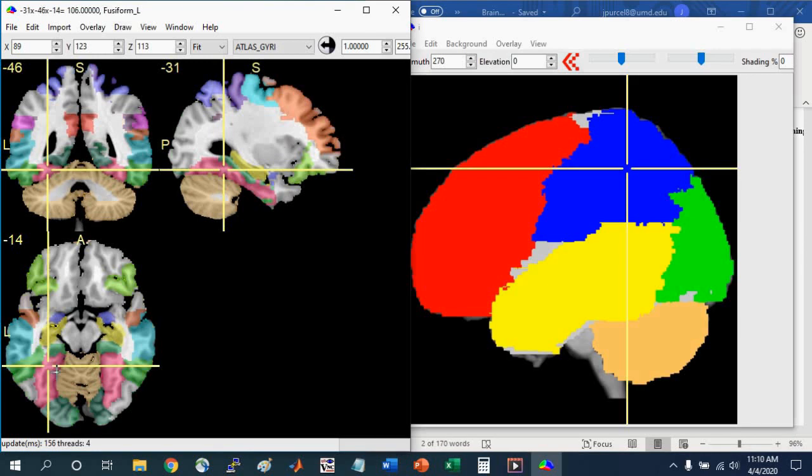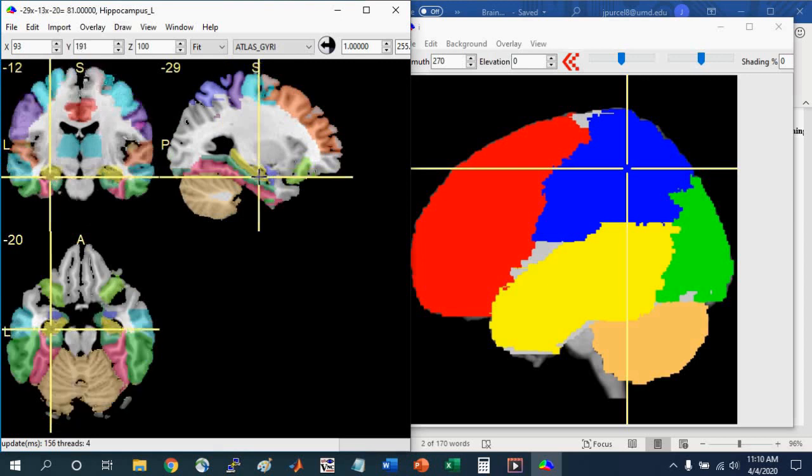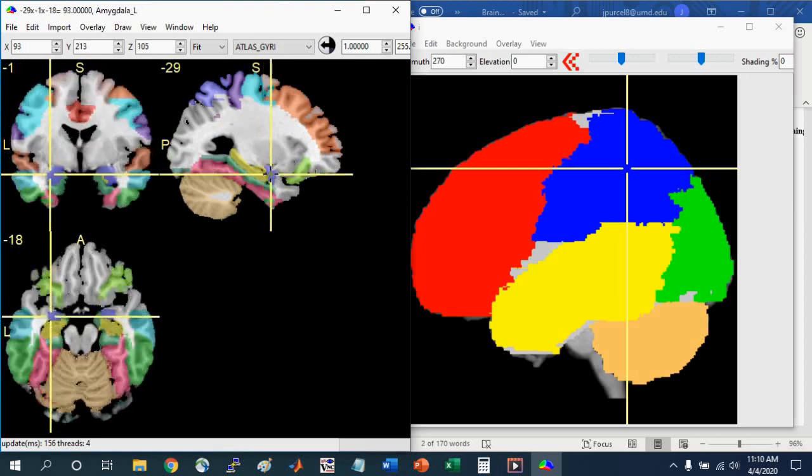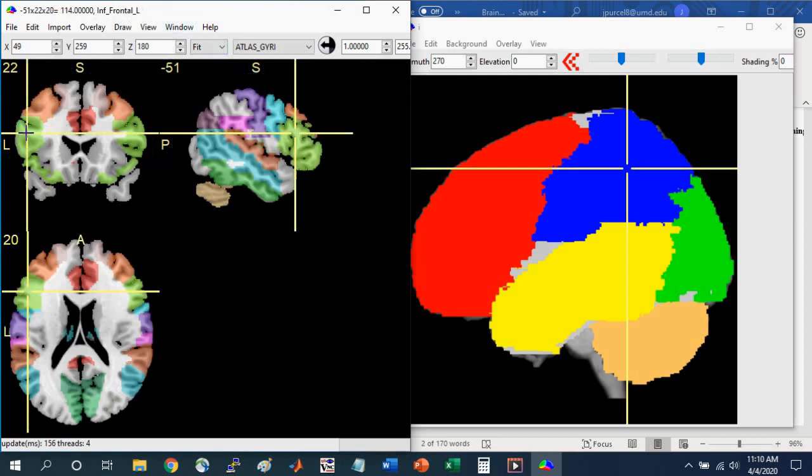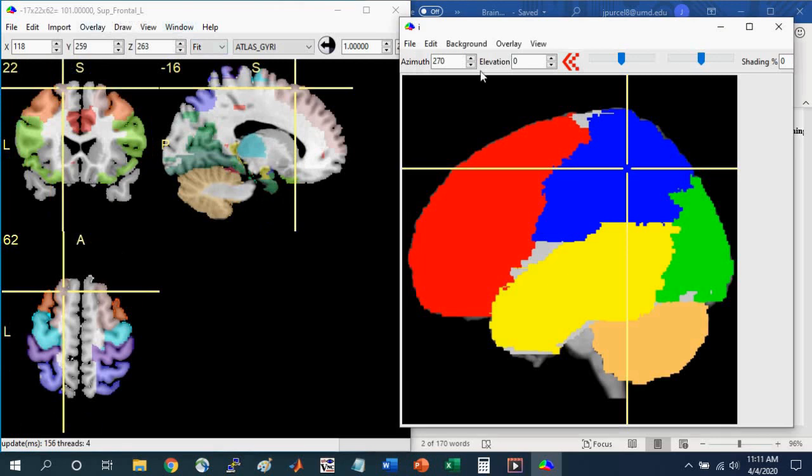For example, I can select this yellow region and see the left hippocampus. I can navigate to the anterior portion and see that just anterior to it is the amygdala. I can jump up to the frontal lobe and see that this is the left middle frontal gyrus. Inferior to that is the left inferior frontal gyrus. Then I can go all the way up to the top and see the left superior frontal gyrus. If you go back to the rendered view and make a change to, say, the azimuth, you can see these structures on the rendered brain.